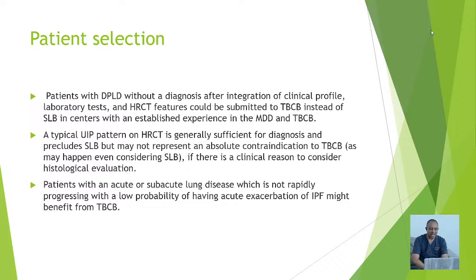But in patients who have other acute or subacute lung diseases, which you are not sure of, and you can identify an area which is easy and amenable to biopsy, then this patient is a good candidate for transbronchial lung biopsy.